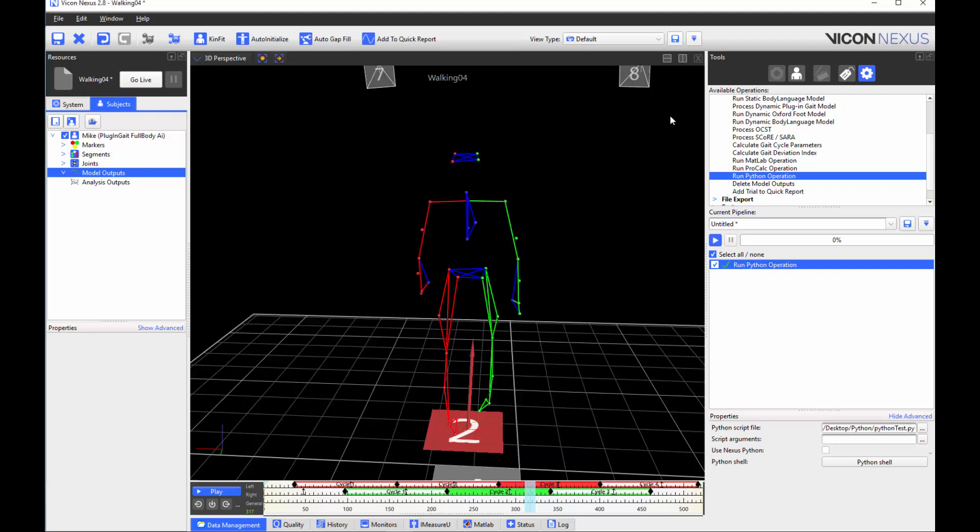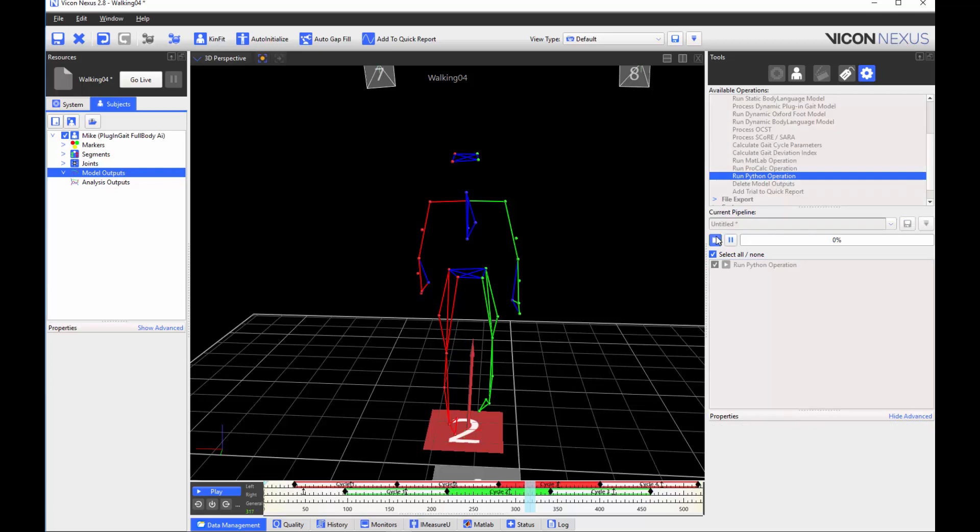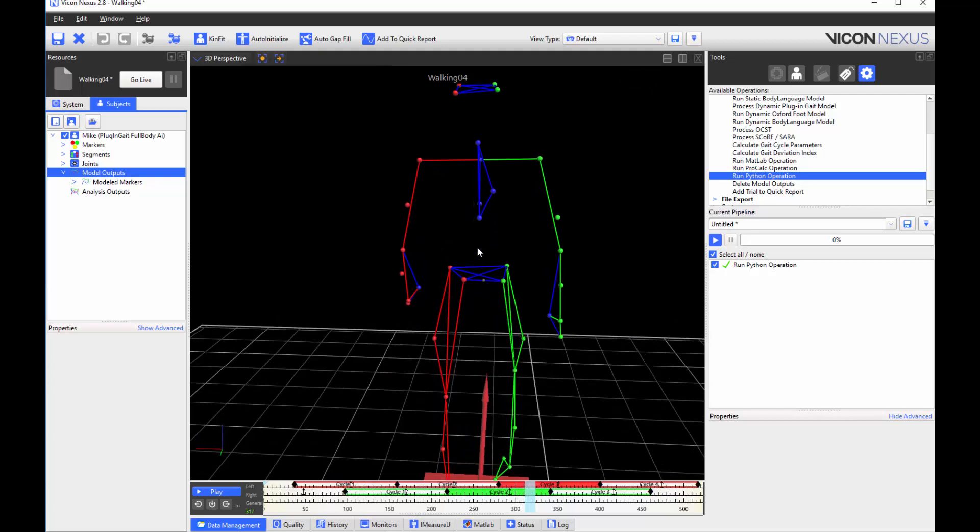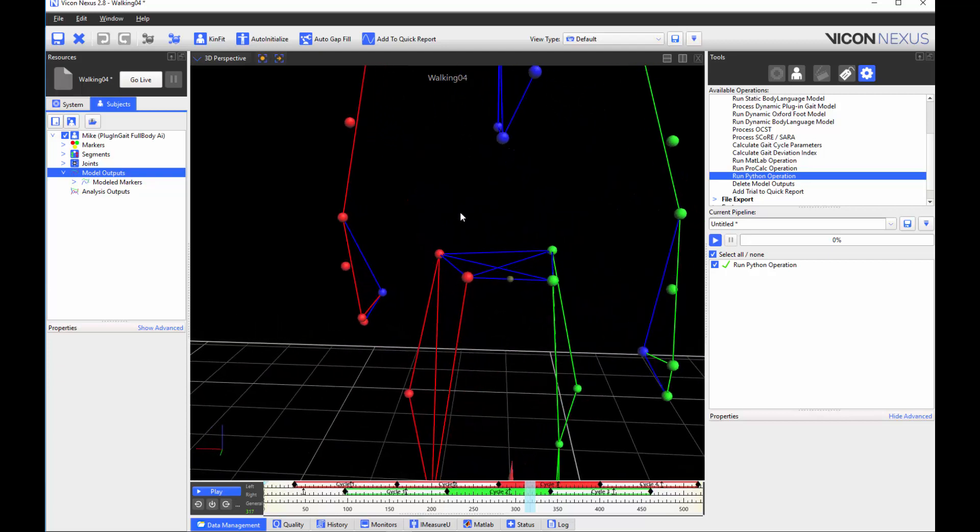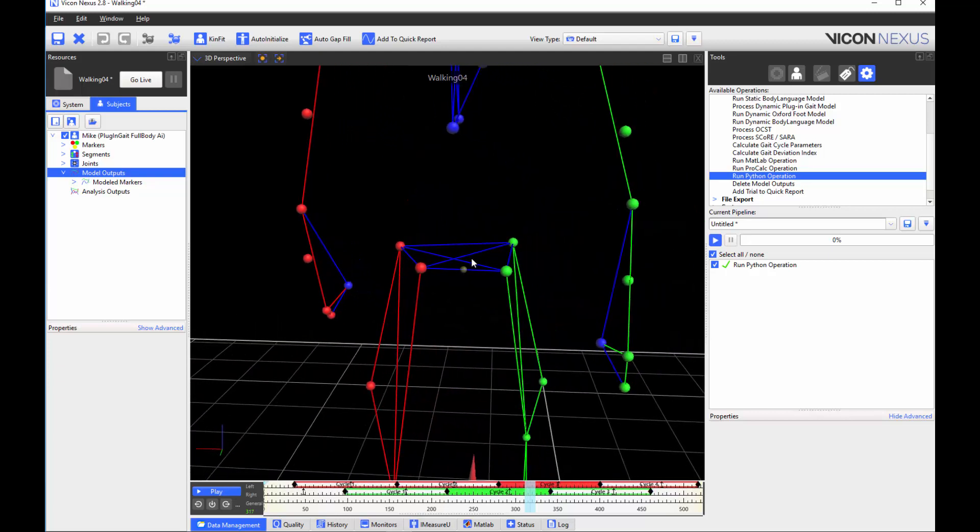I can run this script by using the runPython operation. I have already specified the script file path. You can see the sacrum marker has been created. I can also see it in my modeled markers.